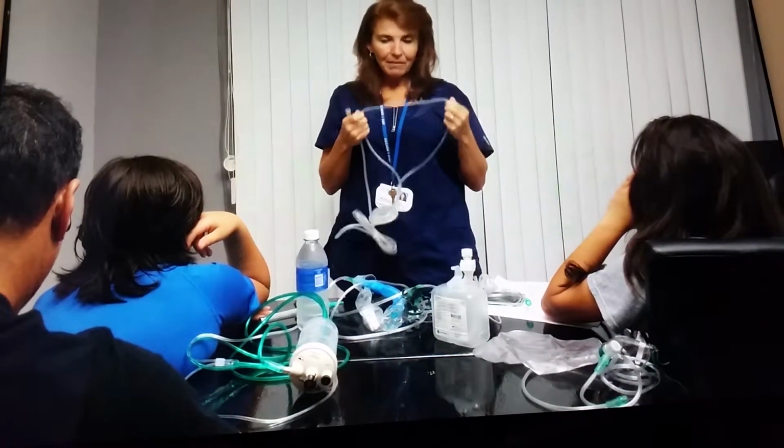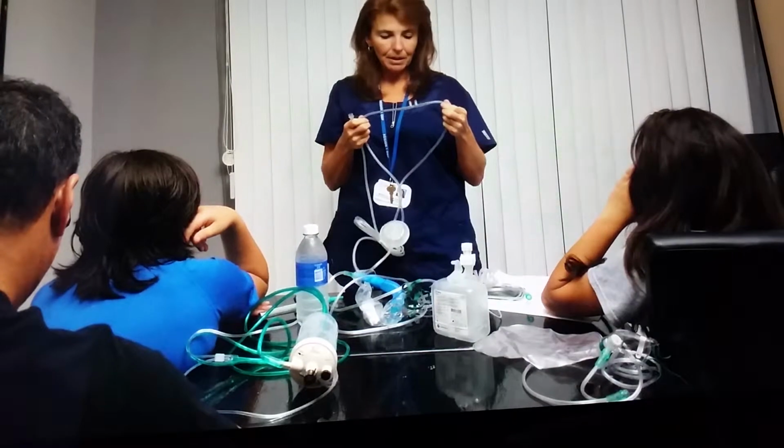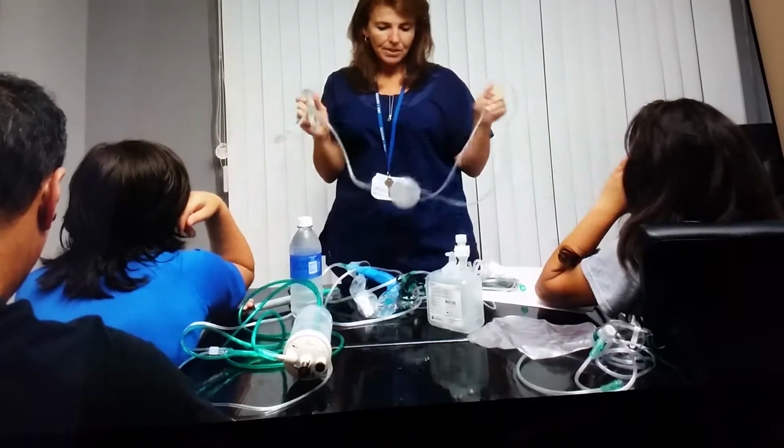So very important, even though it's high flow, this particular device does not require humidity. It's also 6 to 15 liters, and you can transport patients on this type of device.